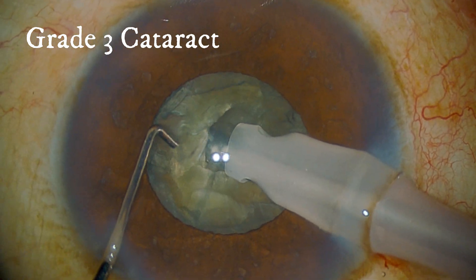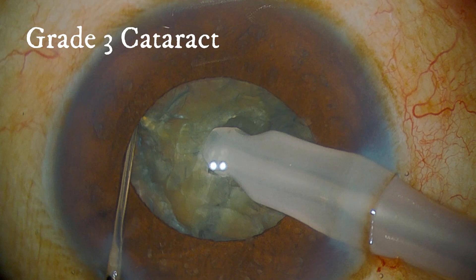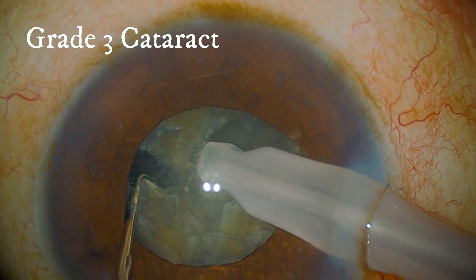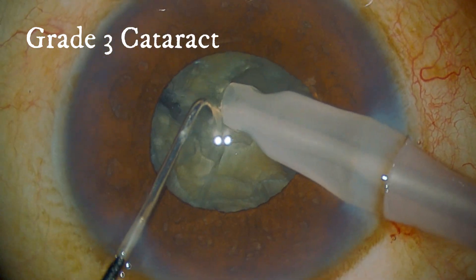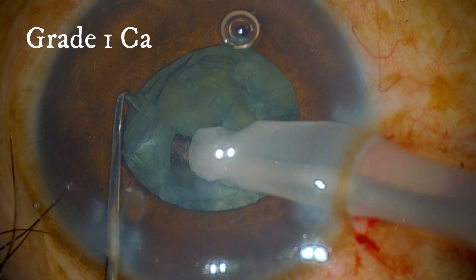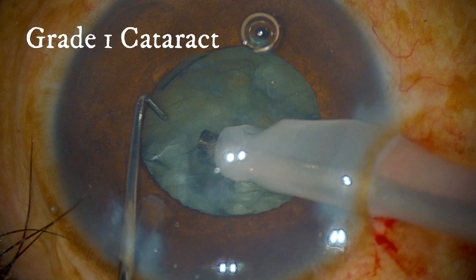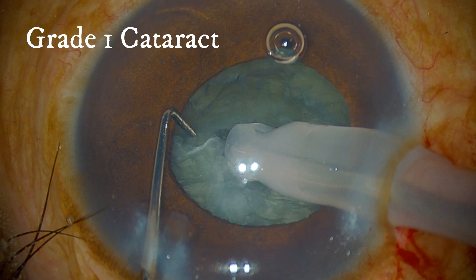The grade 3 cataract — I am chopping it. Just watch all the steps very carefully. And then I am going to show grade 1 cataract, which I am also chopping.